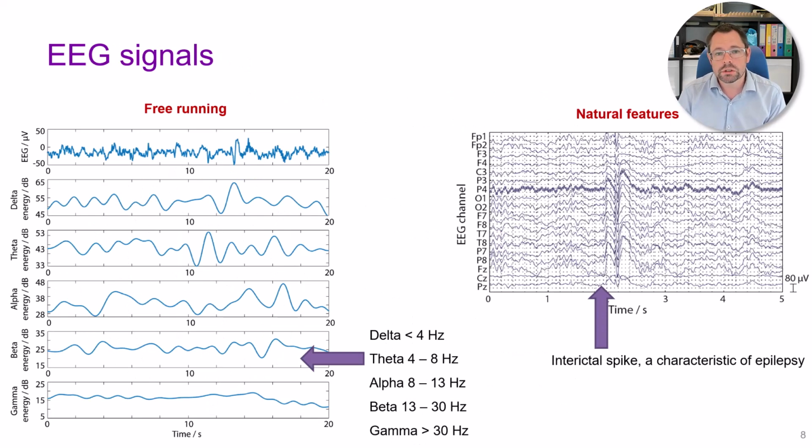Once you've got your EEG set up and collecting data, there's a number of characteristic waveforms that we can start to identify. The EEG is not like the ECG. For heartbeats, there's a very characteristic clear waveform. EEG signals are much smaller, much harder to interpret, but there are common features that we can start to see.